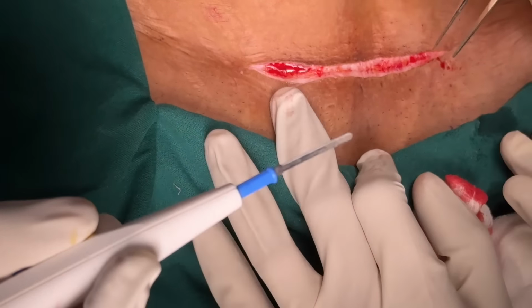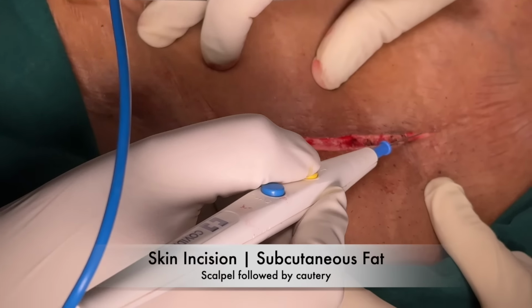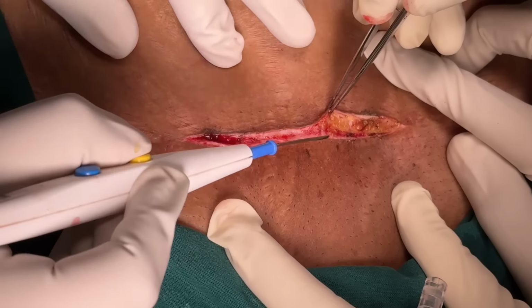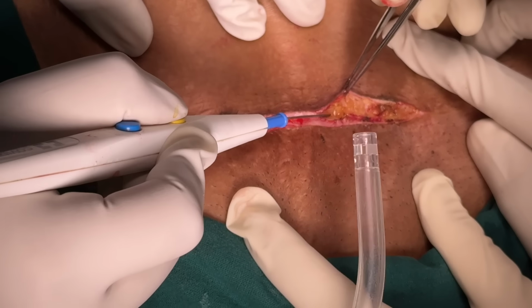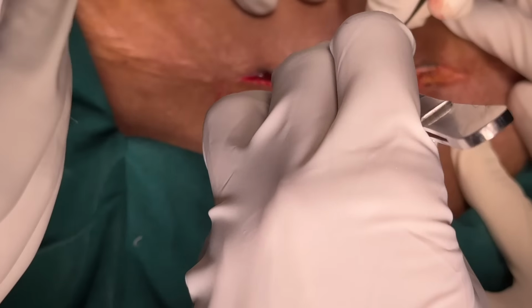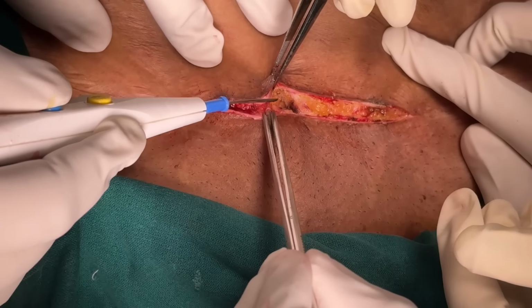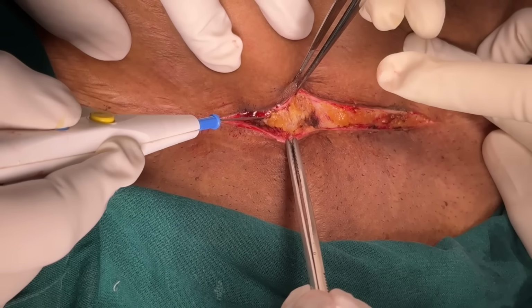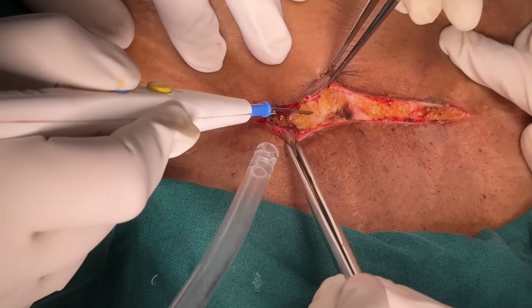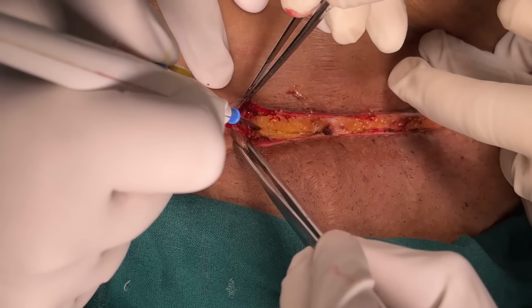The surgery starts with giving a skin incision. For skin we use a scalpel blade, and for subcutaneous fat we usually use a monopolar cautery pen. When you cut with cautery, a trick is that you have to be very slow as compared to cutting any tissue with a knife or a blade. The reason is that cautery is simultaneously doing two functions. First, it coagulates and then it cuts. So you have to be slower in your pace as compared to cutting with a sharp knife.